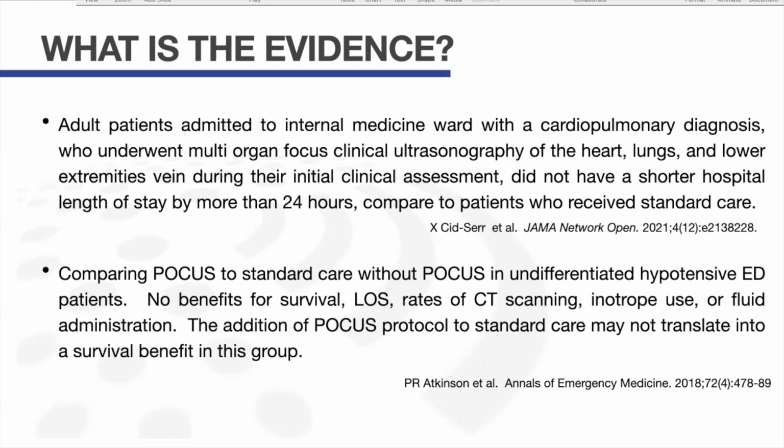who received standard care. Another study published in 2018 compared POCUS to standard care without POCUS in undifferentiated emergency department patients who presented with hypotension. There were no benefits in terms of survival, length of hospital stay, rate of CT scan, inotropic use, or fluid administration. So the addition of a POCUS protocol to standard care may not translate into survival benefit for the patients.